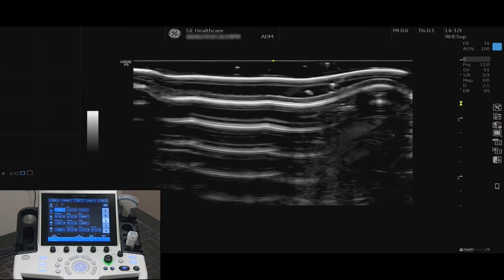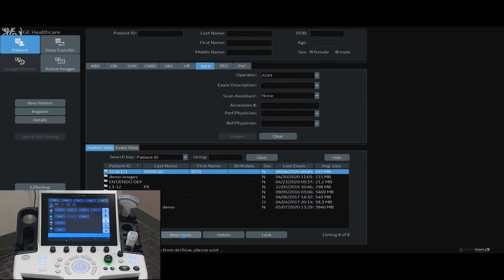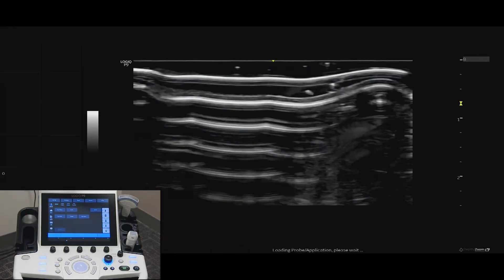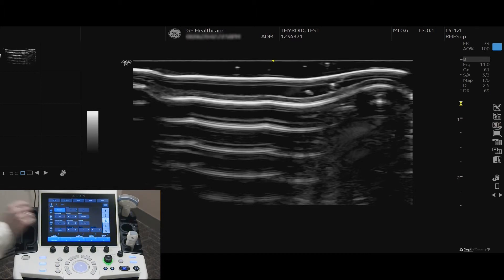Begin a new exam on a patient that is currently stored in the hard drive. Select the probe that was previously used. Select Compare Assistant from the configured user-defined hard key or the icon on the right side of the monitor.